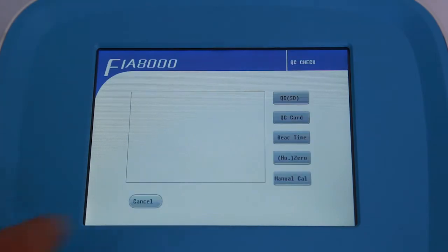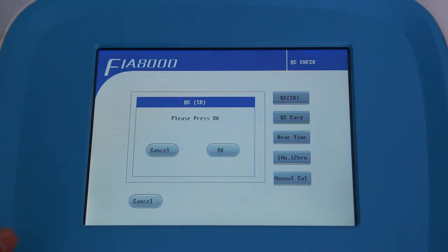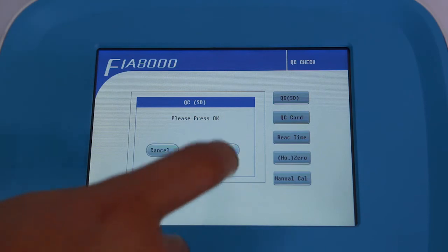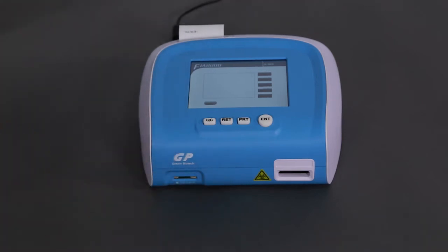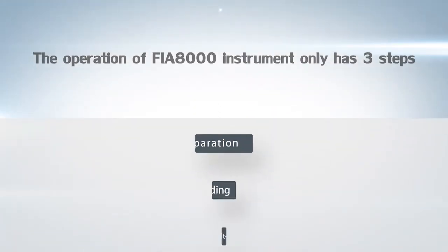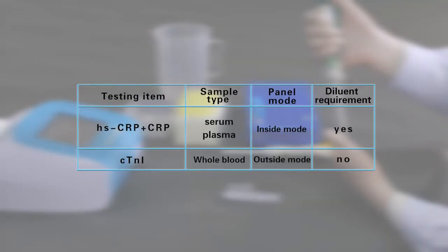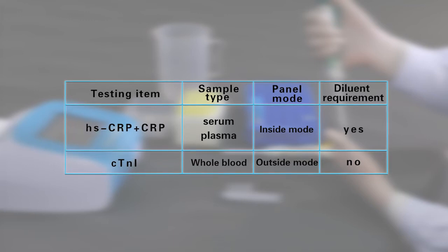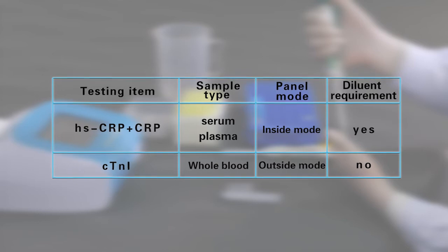Click QC Check on the main interface or press QC. Then click QC SD and insert the QC card properly, then click OK to complete the QC process. The operation of the FIA 8000 instrument only has three steps, which is very simple. The testing process can generally be categorized into two types according to diluent requirement. The tests of HSCRP and CTNI are used here as demonstrations.